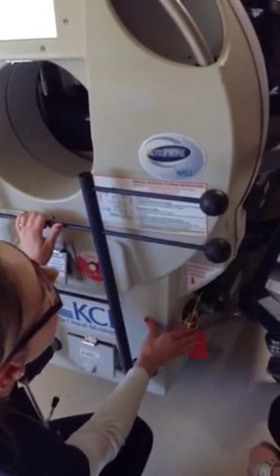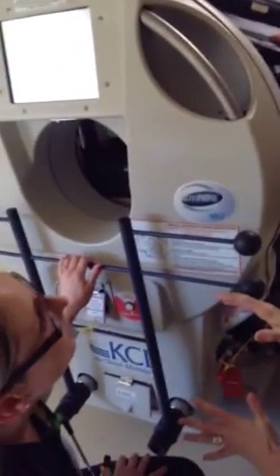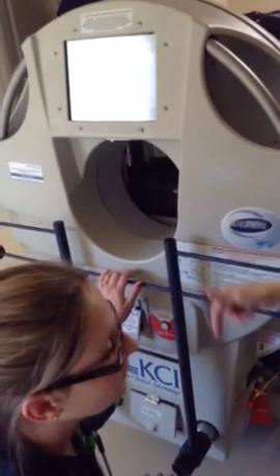Which direction are we proning in? Because you're going to be down here like, which direction are we going? We're going to go counterclockwise. Okay, so counterclockwise, okay?